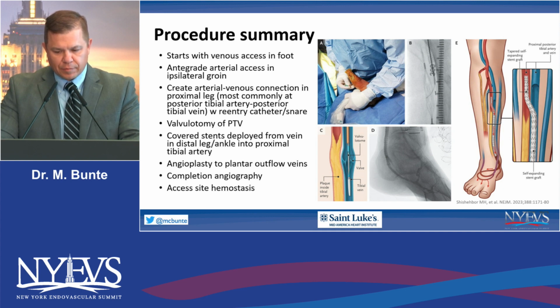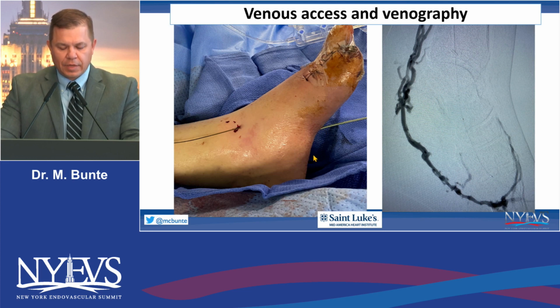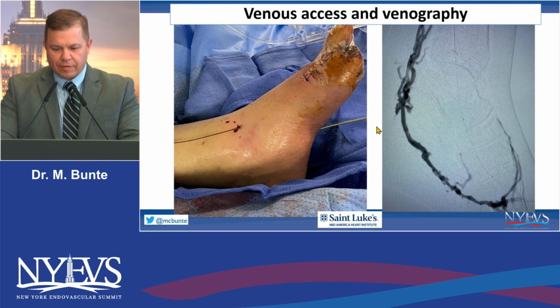And so you have to really be diligent about making sure that your angioplasty extends out into the midfoot and then achieving access site hemostasis. This was my very first case where I screwed up the venous access, caused the vein to spasm, couldn't get in. Then I had to use the medial marginal vein and go through the foot to eventually have a point to access and get my lateral plantar venous sheath in.